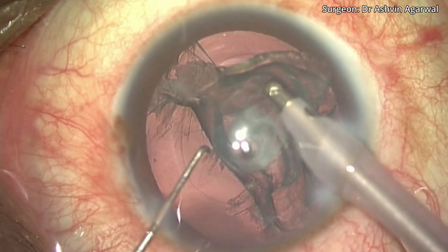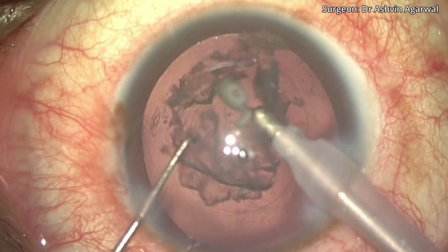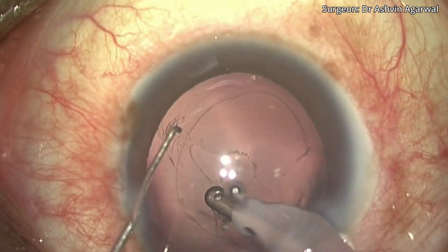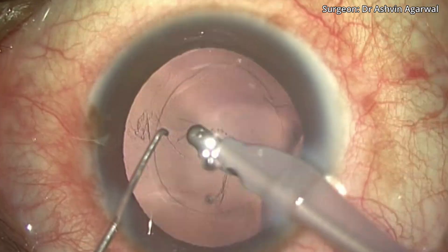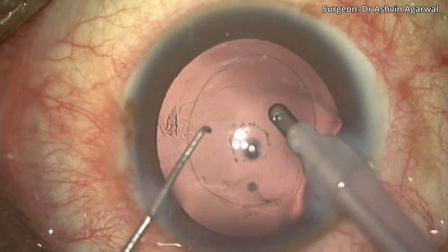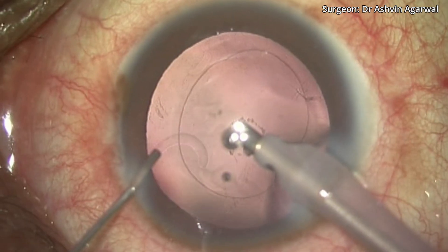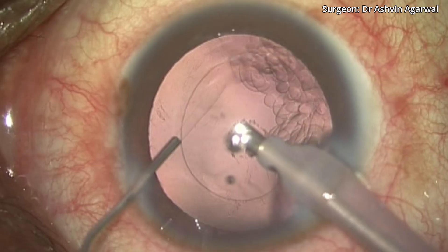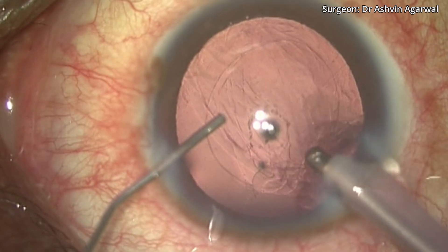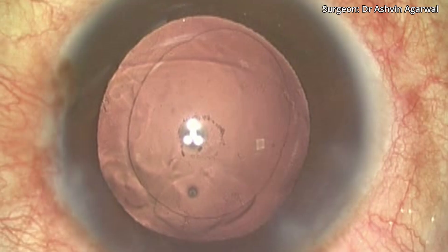Once the cortex is loosened all around, tease and release the polar component from its attachment. Avoid anterior chamber collapse as it can cause a posterior capsular rupture. Before withdrawing your phaco probe, fill the anterior chamber with dispersive viscoelastics through the side port.